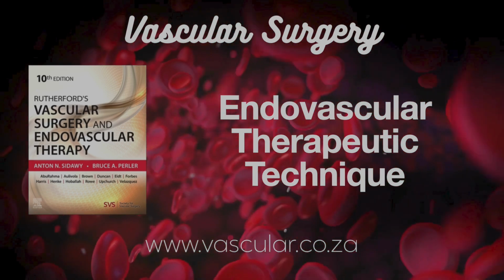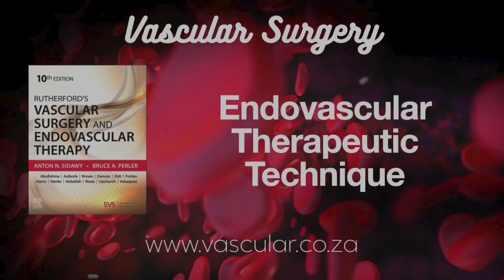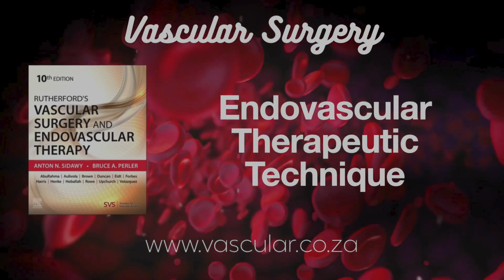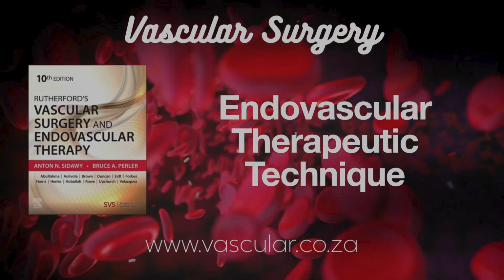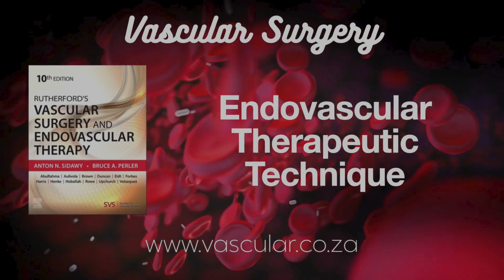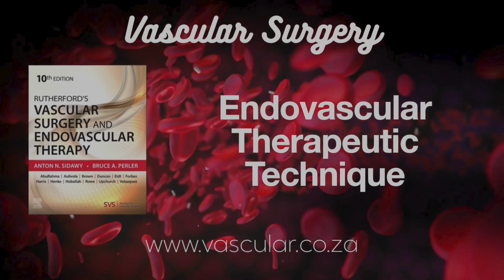So still a work in progress for peripheral. Very much so. It's unclear if or when the technology will get to the point where it can reliably replace durable metallic stents for PAD. The long-term potential is there, but current peripheral BVS haven't matched the performance of existing metal stents yet. Okay, that's a great tour of the stent landscape.